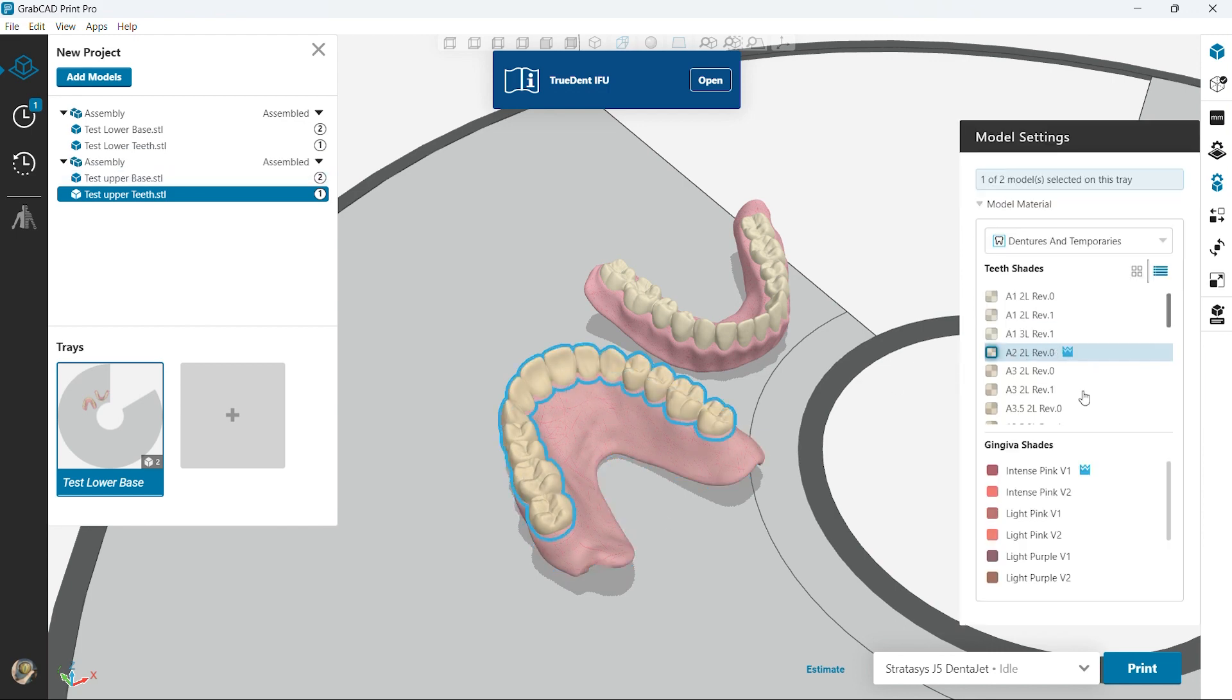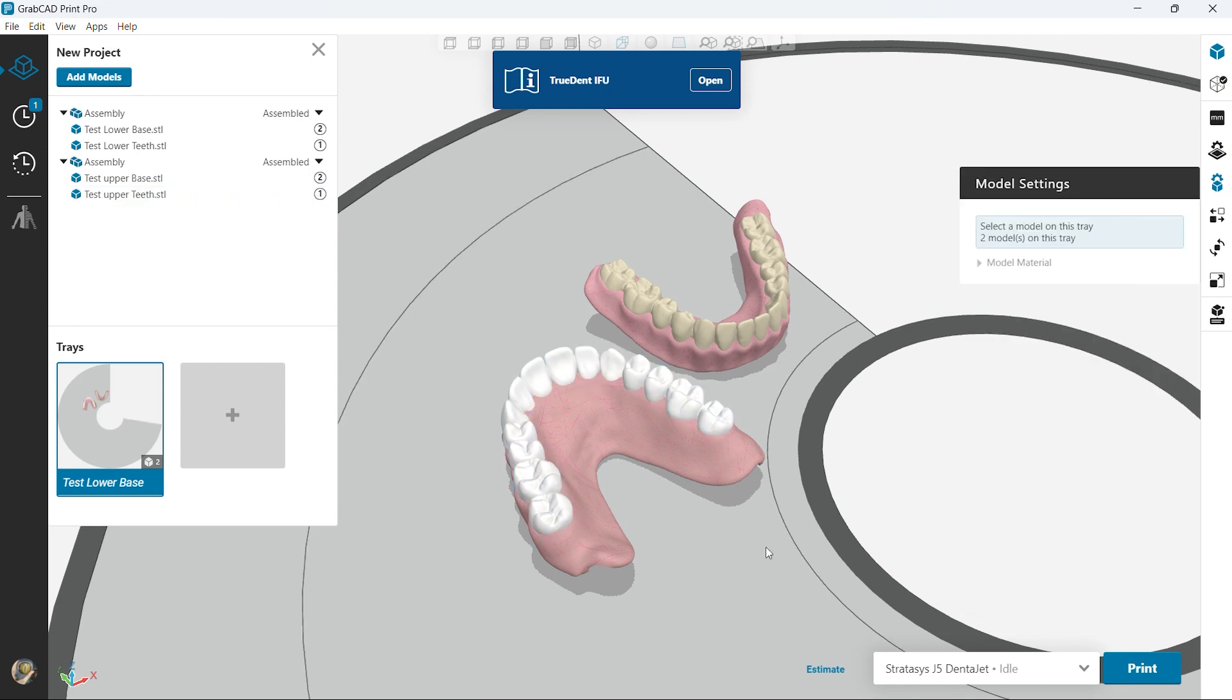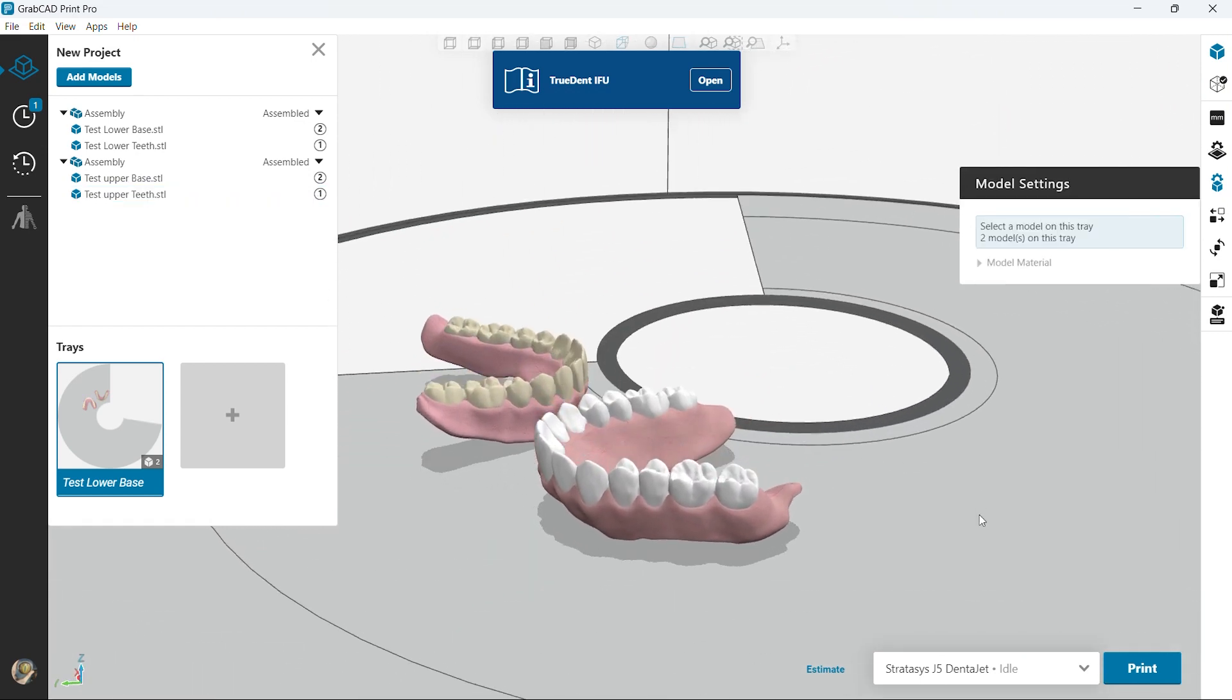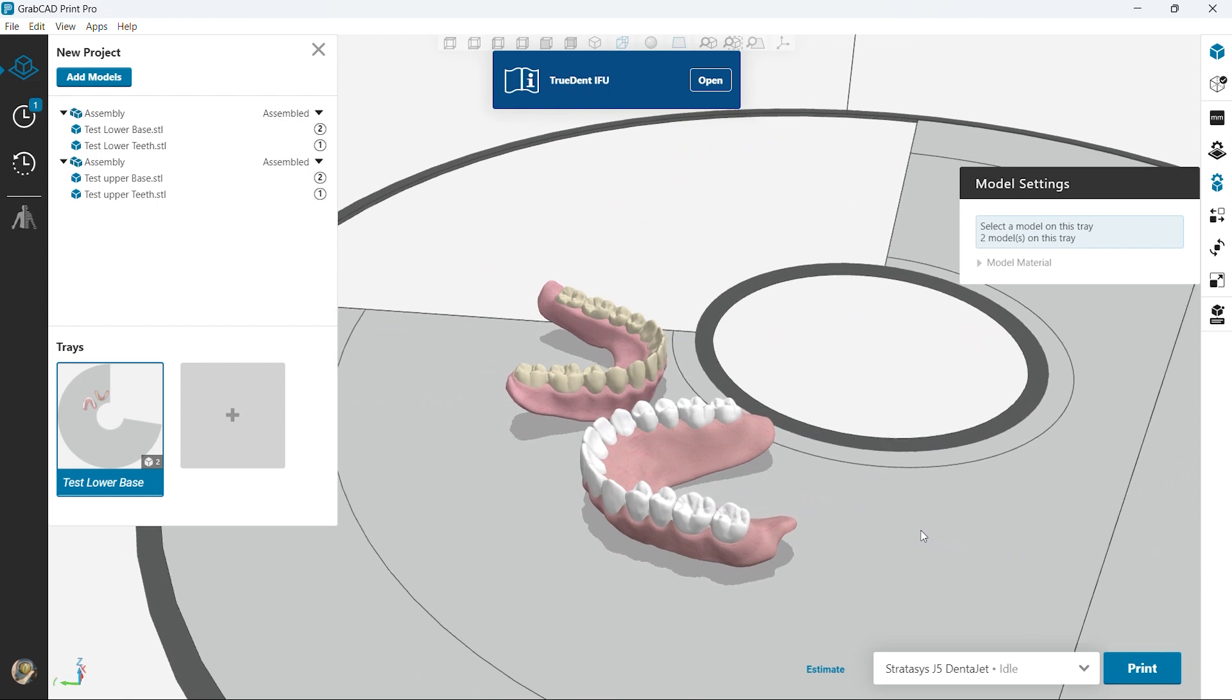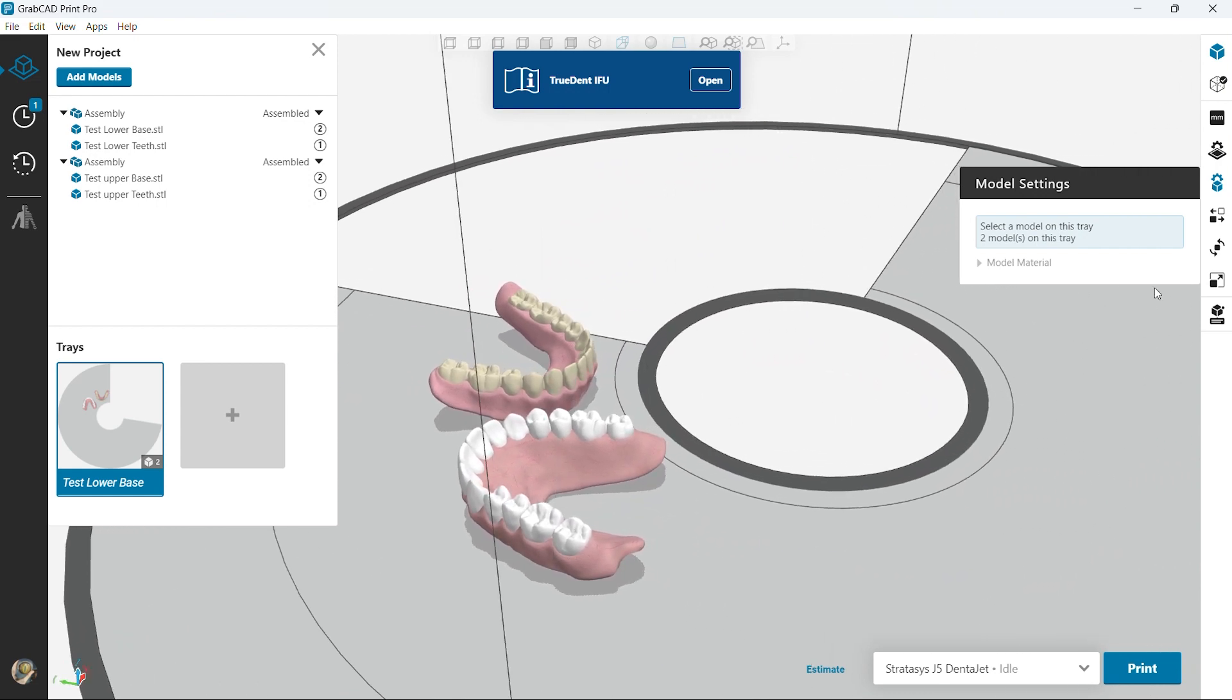But in the meantime you can change the color in GrabCAD and you have the whole library there. So right here you have a very white bleach shade. And again, these two dentures can go on the same print at the same time.